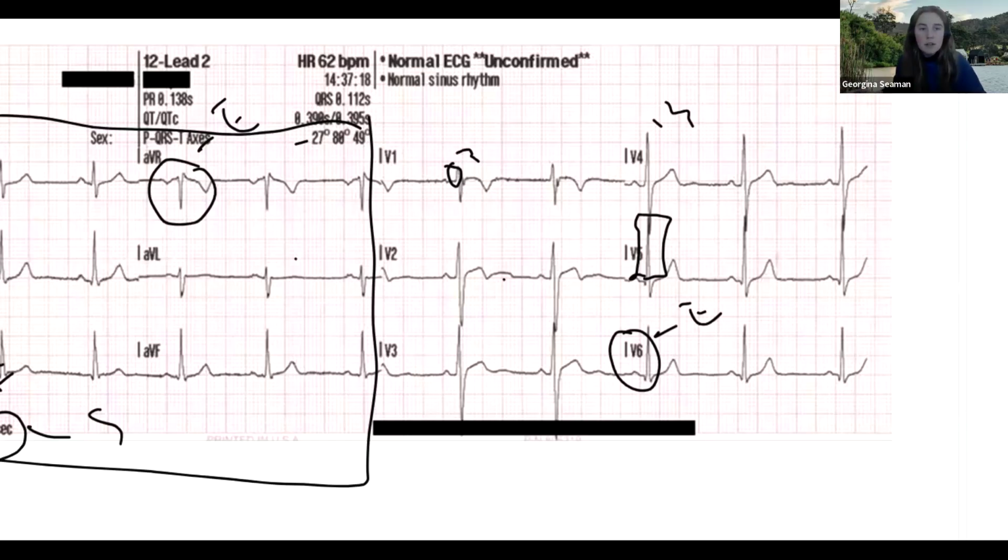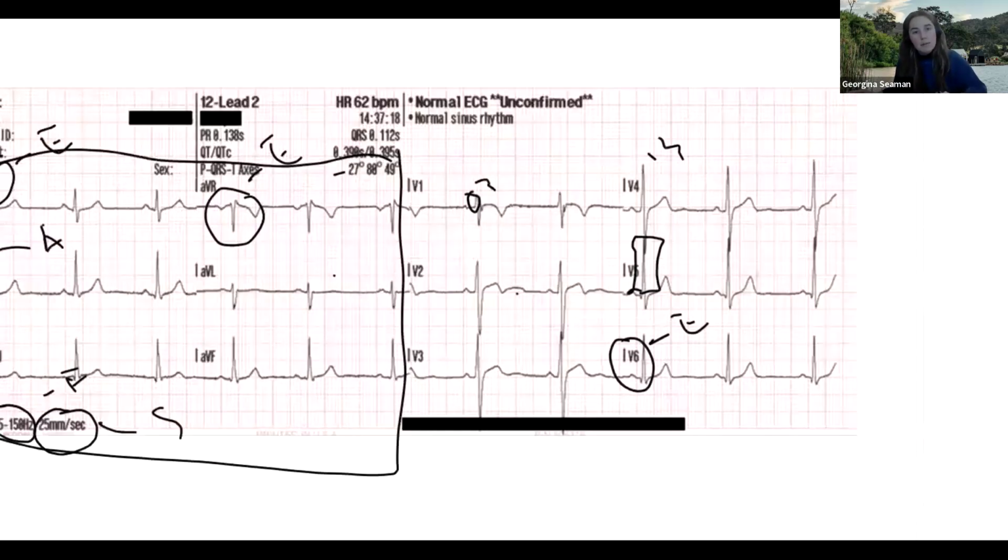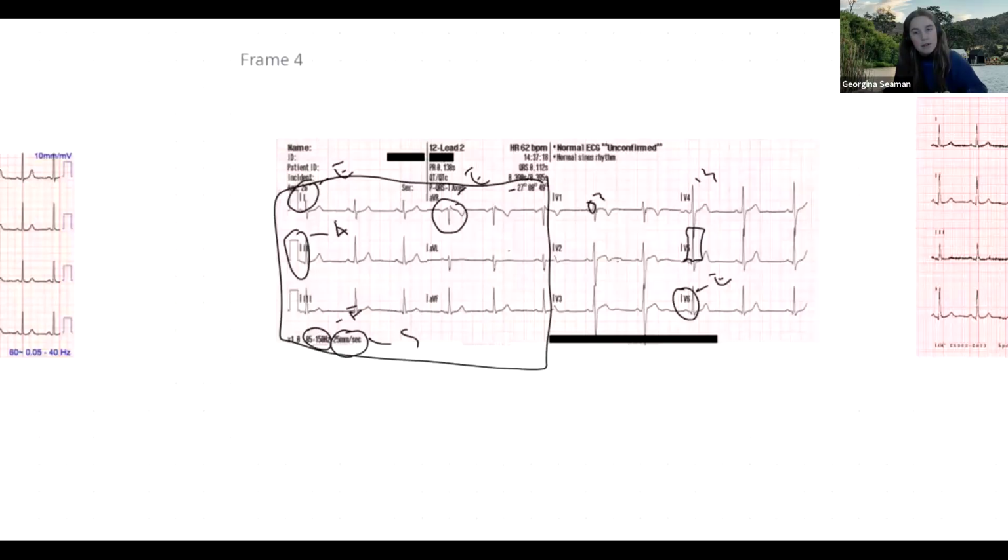This is probably a good opportunity. You need to go back a step and go back to the views of our heart and the precordial leads. Yes, absolutely, Chloe. We are looking for signs of ischemia. And to Zoe's point, because the leads are closer to the apex of the heart, absolutely.